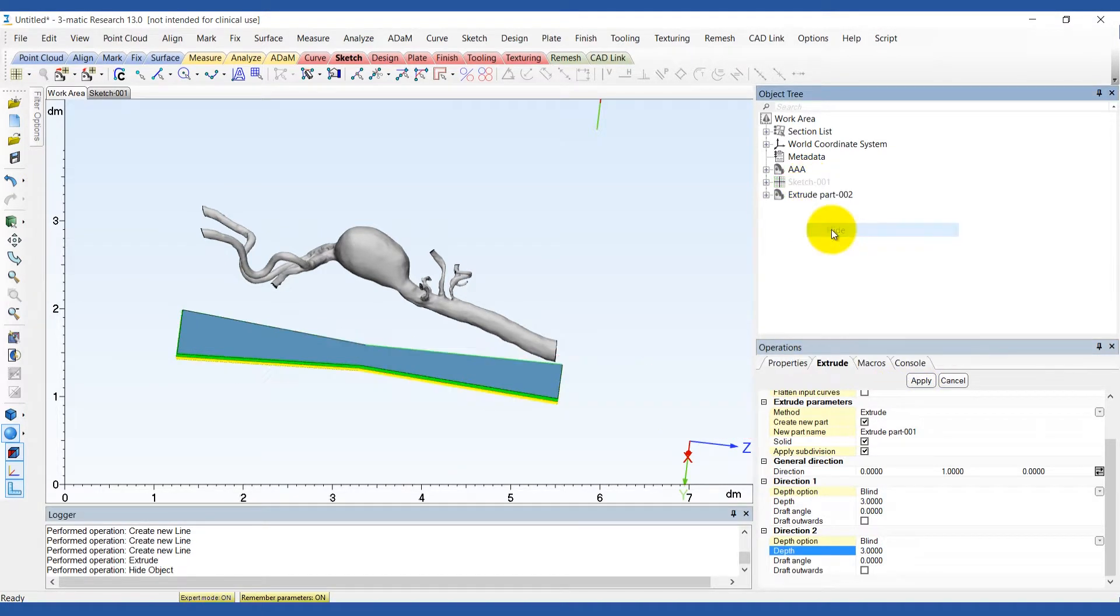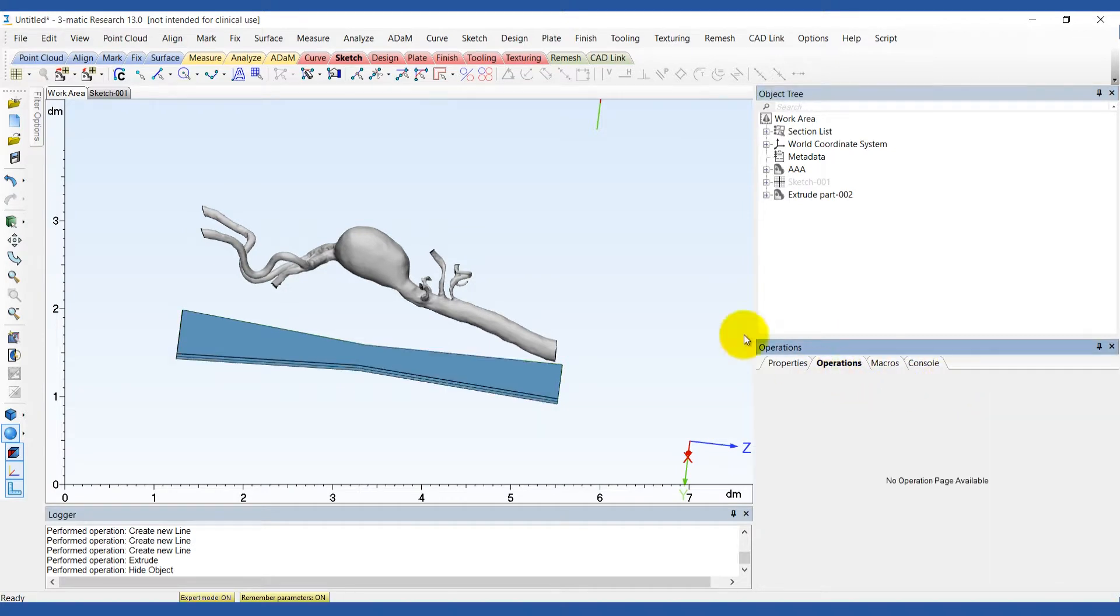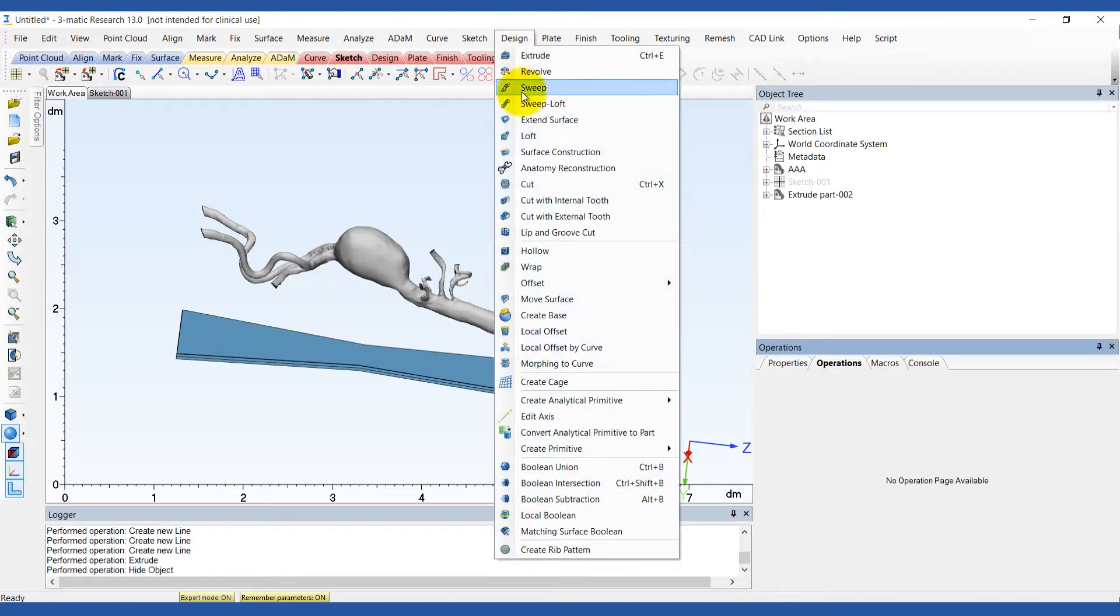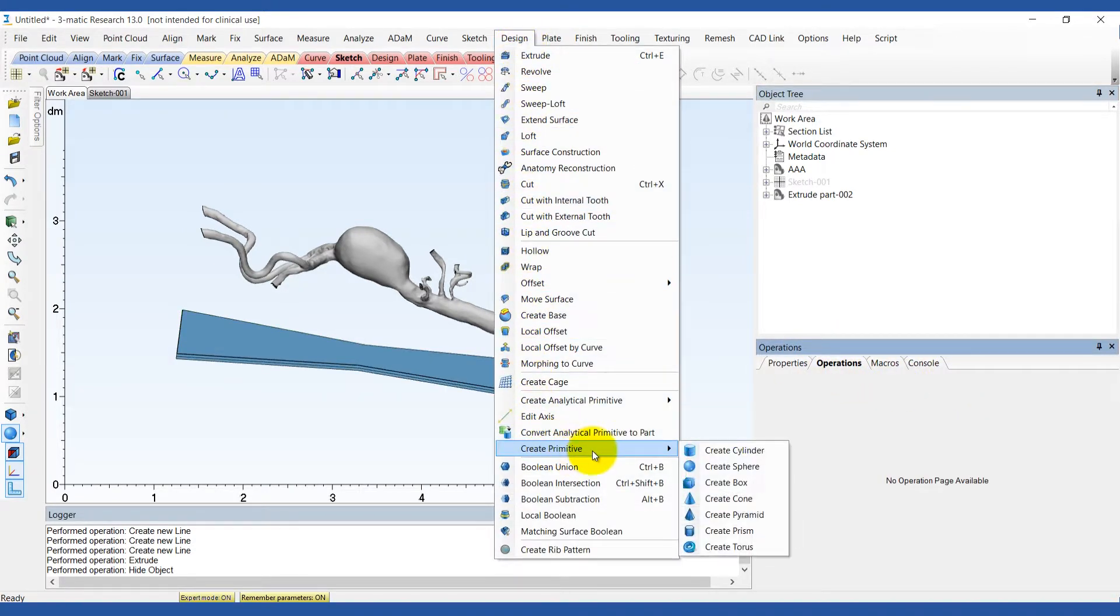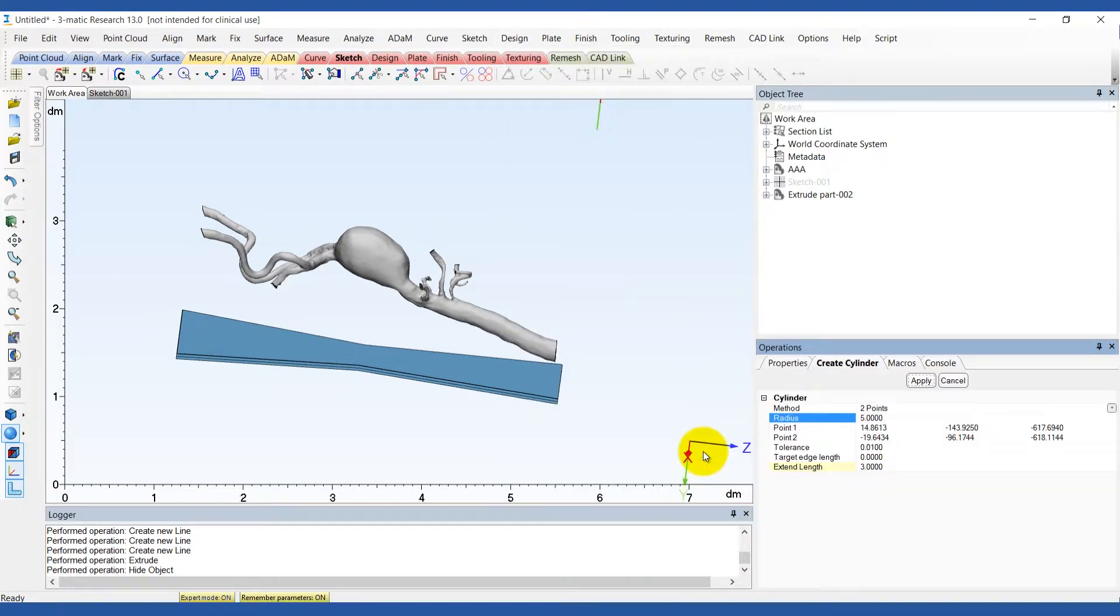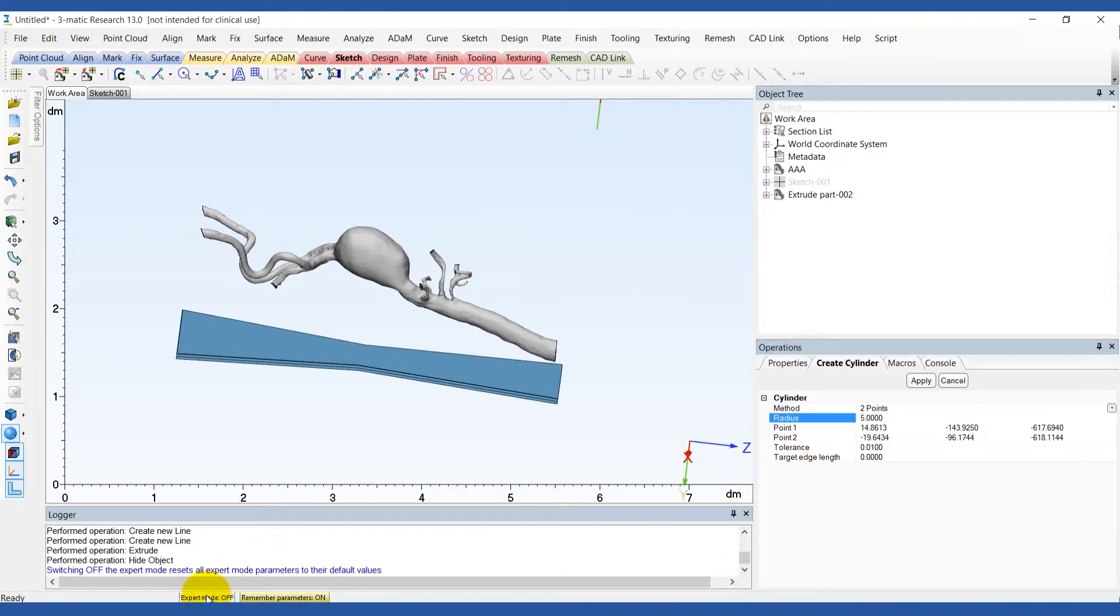Hide the sketch and now we are ready to design a support to attach the base to the aorta. Be sure to select the expert mode with the option extend length so that the cylinders will fully intersect with the aneurysm model.